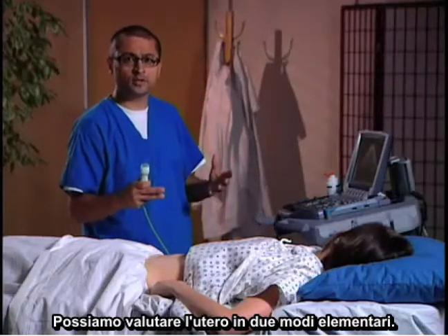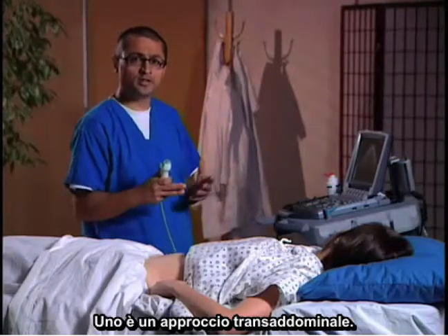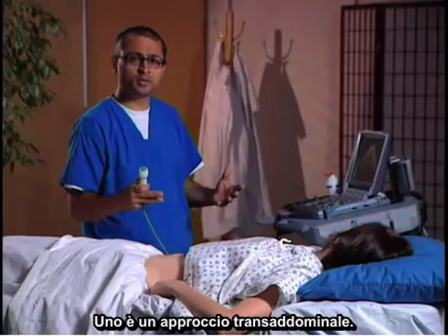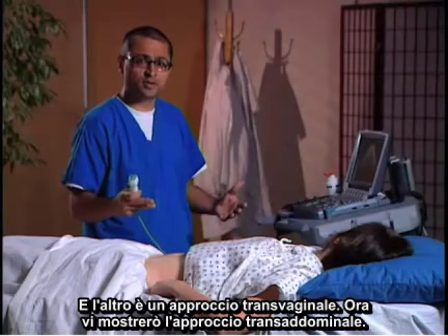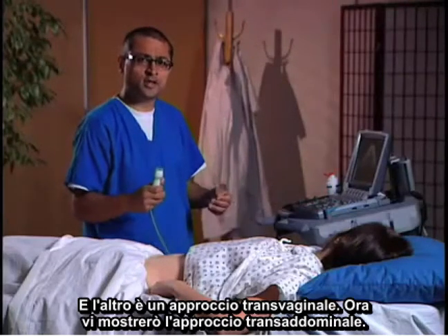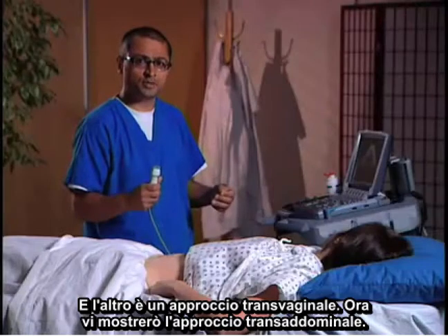We can evaluate the uterus in two basic ways: one is a transabdominal approach and the other is a transvaginal approach. Right now, I'm going to show you the transabdominal approach.